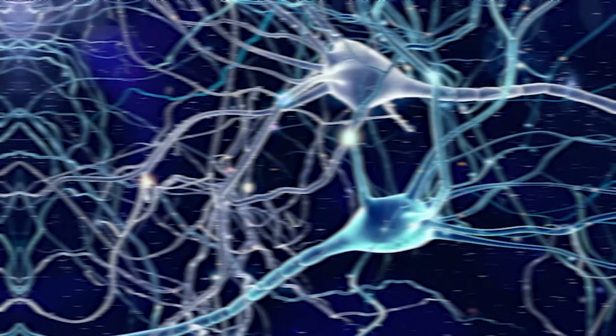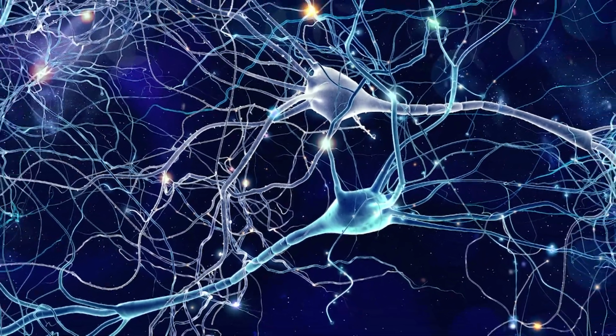The basic principle of EEG is that brain activity generates electrical signals due to the communication between neurons. These electrical signals, often referred to as brain waves, are a crucial indicator of brain function, cognitive states and neurological disorders.